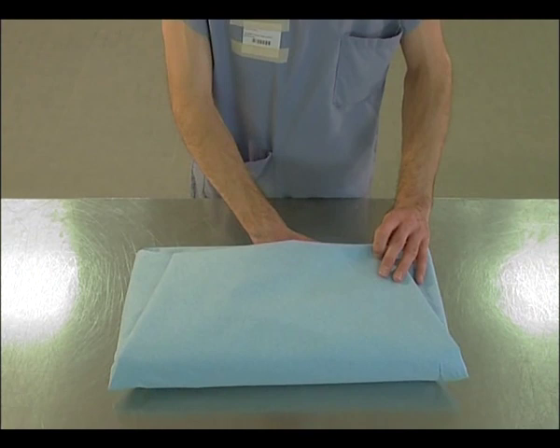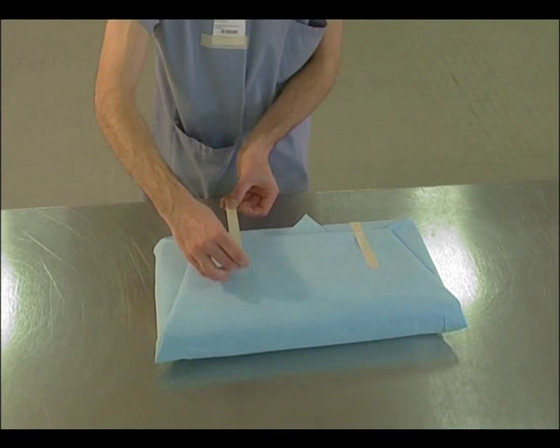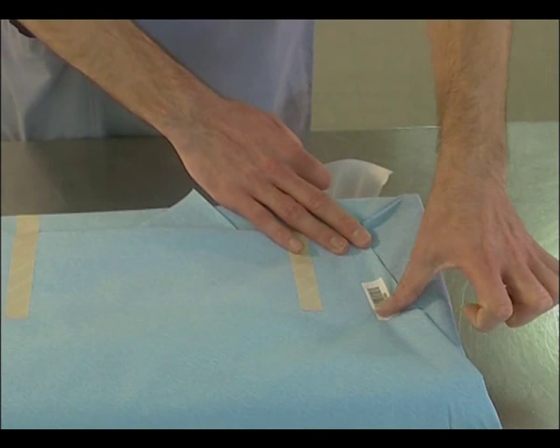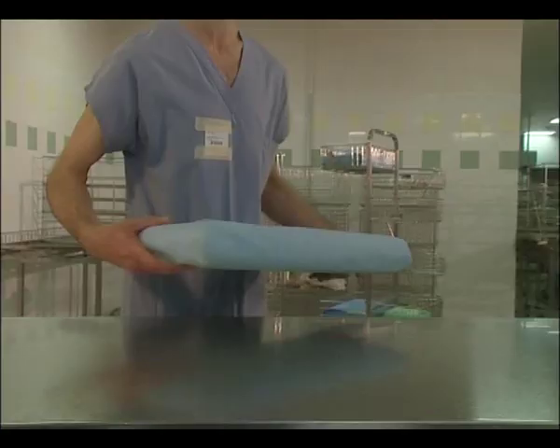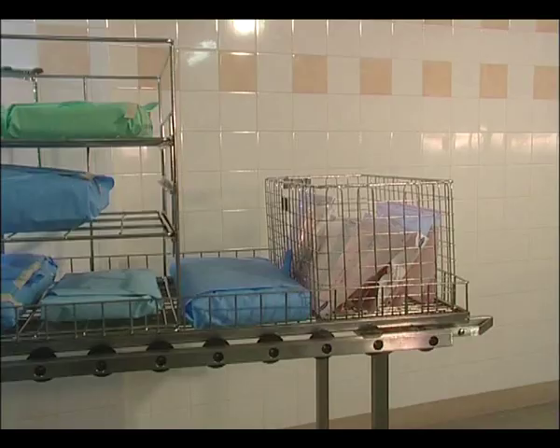In most cases, the pack is closed with an adhesive tape that might have on it indicators for sterilization. A traceability label is applied. The folding is finished. The pack is now ready for sterilization.